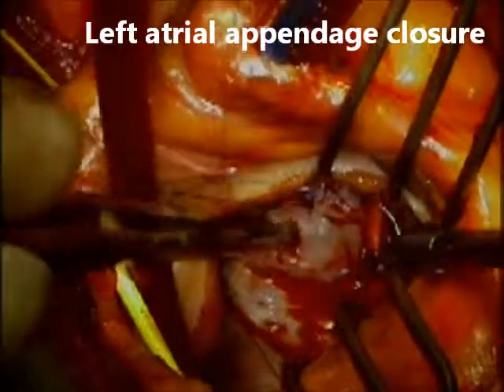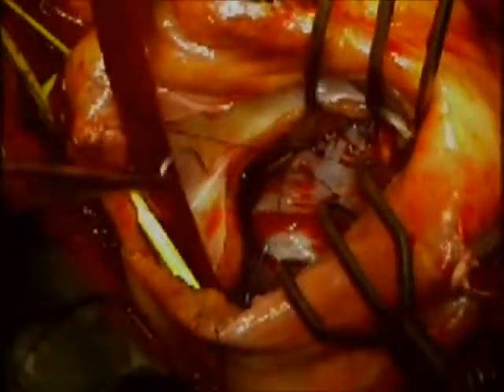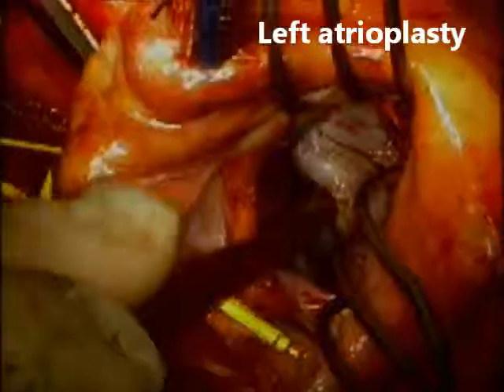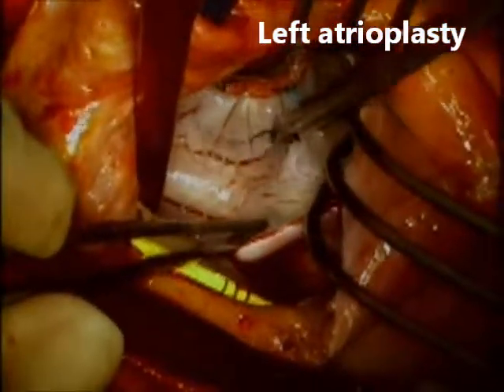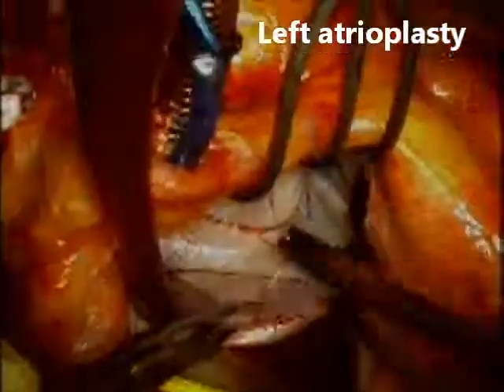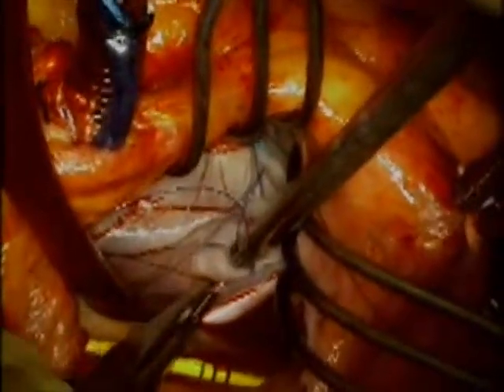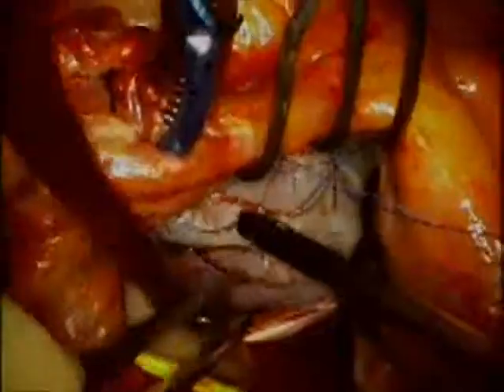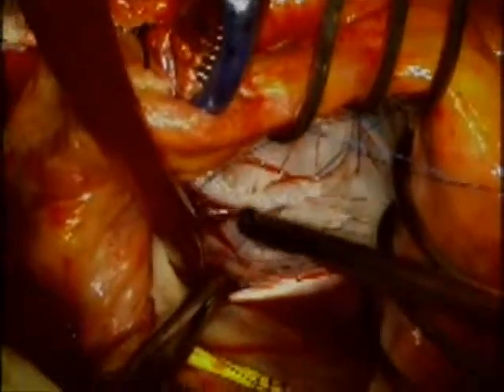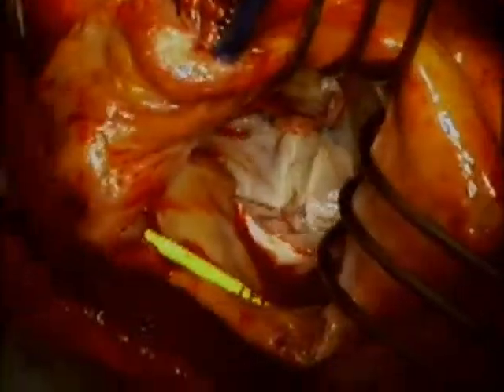Next, I proceed with left atrial appendage closure by doing two running suture lines at the edges of the orifice of the left atrial appendage using 2-0 prolene. Once the left atrial appendage is closed, I focus on the large fold visible on the posterior wall of the left atrium — that is the area I will use to perform the left atrioplasty. Stitches go in and out of the atrial wall on both sides of this large fold so that when tied in a running fashion, it everts the entire fold and leaves a smooth suture line on the atrial side. Using this technique, you can typically eliminate 3 to 4 cm of left atrial circumference, reducing the left atrial volume to a normal size.